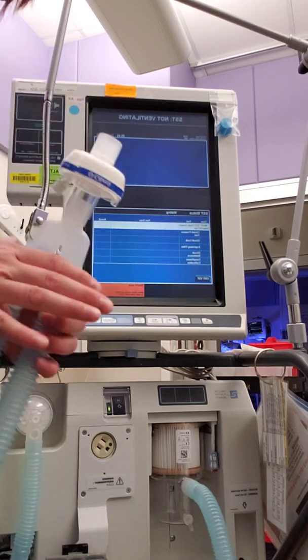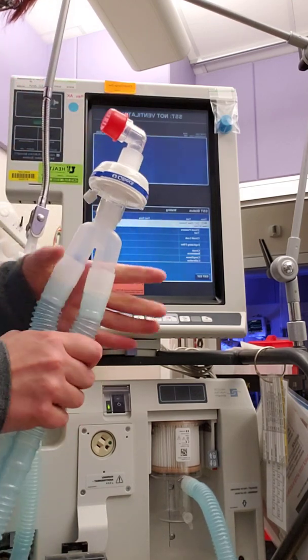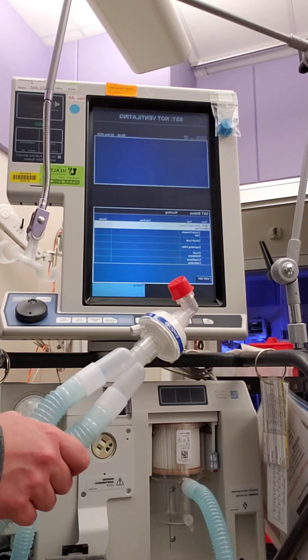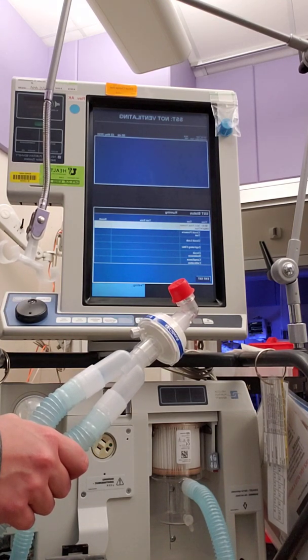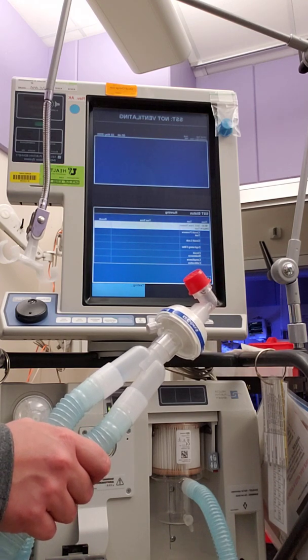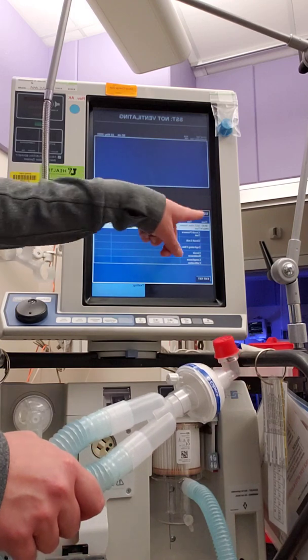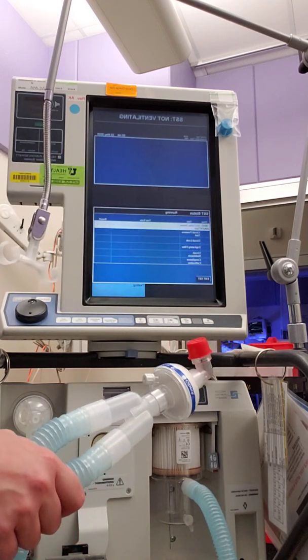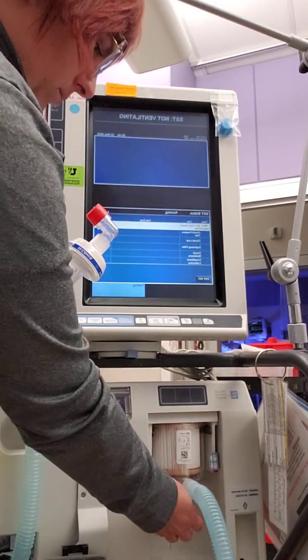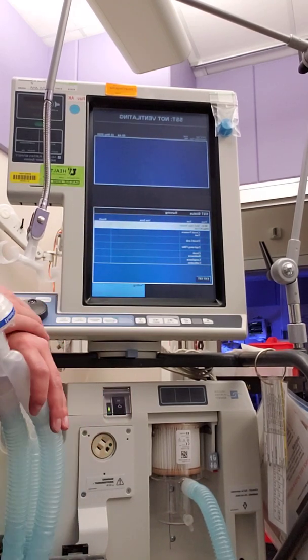Block the Y. So I'm going to plug this. We're going to block the Y, and then we're going to press accept. Over here you can see the date and the time while it's testing. Takes a minute, I'm sorry guys.